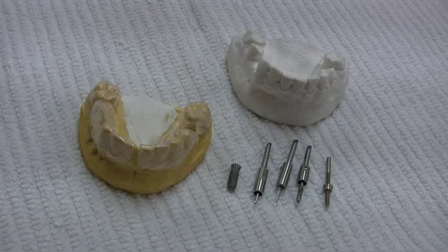Hello, my name is Dr. Emil Verbin. Let's review the drilling sequence using my drill stop and guide.